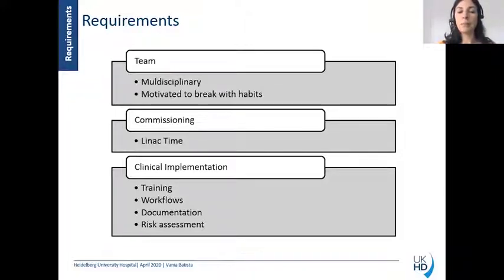A multidisciplinary team where RTTs, physician and physicist work together to define a workflow is really the most important step. Of course, you need to dedicate some LINAC time to commissioning, so that you understand how your system works. Using this information, you can then adapt your workflows to define the training for the entire team, and dedicate also some LINAC time for the training.